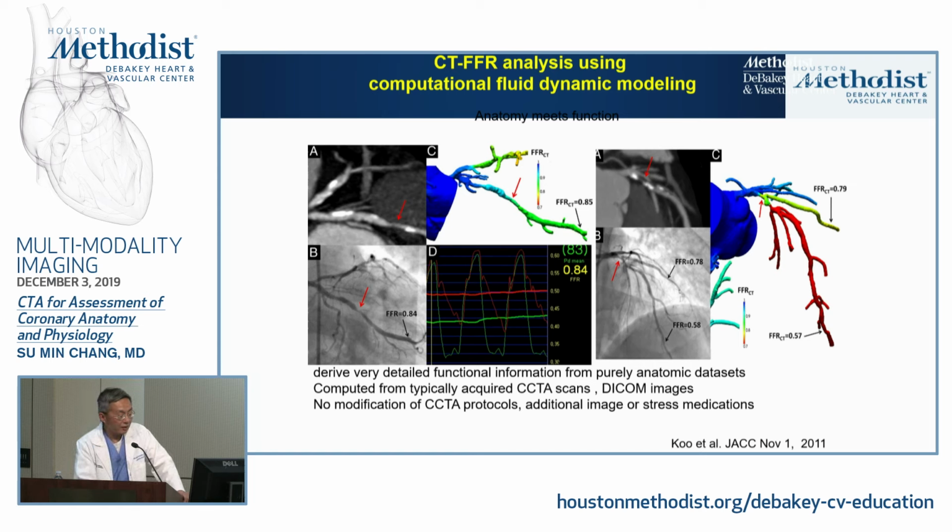But the real, I would say excitement, one of the major breakthroughs was when this technology called CT-derived FFR was described almost 10 years ago. What's attractive about this CT-derived FFR is you don't need to do a stress imaging. So you can just do your routine CT, and you can derive FFR from the CTA information, okay?